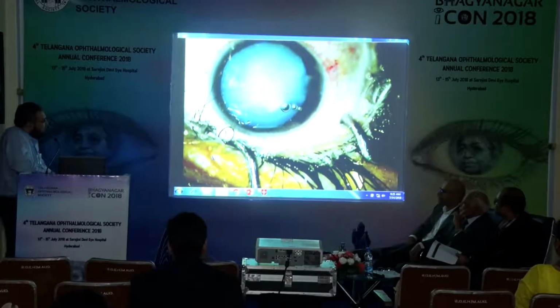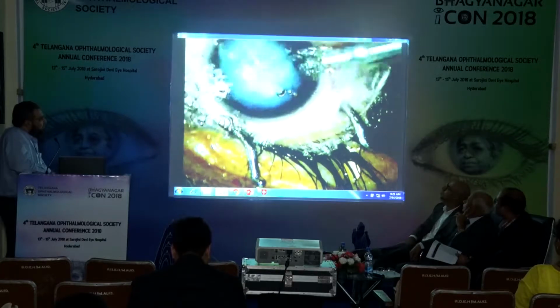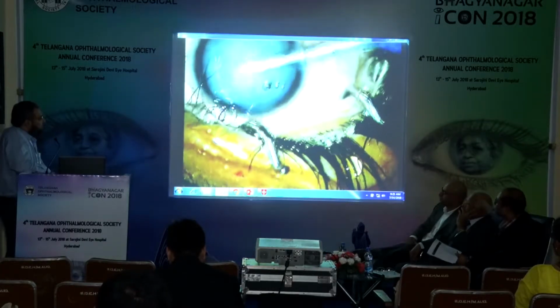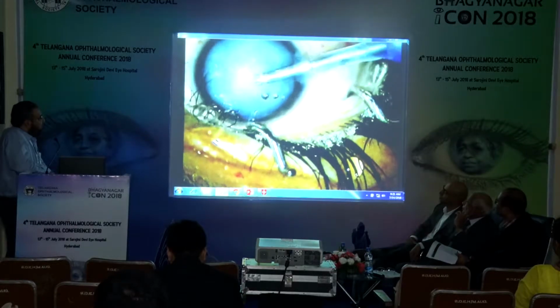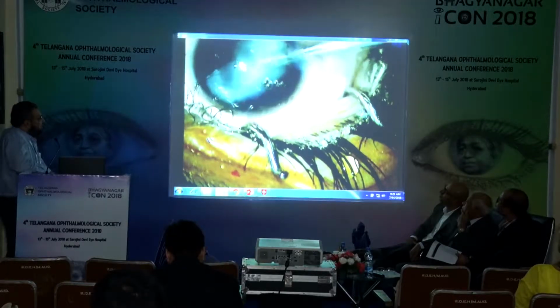Now, as I start the phaco, it hardly takes 10 seconds for the whole of the cataract to be removed. This is a real-time video.